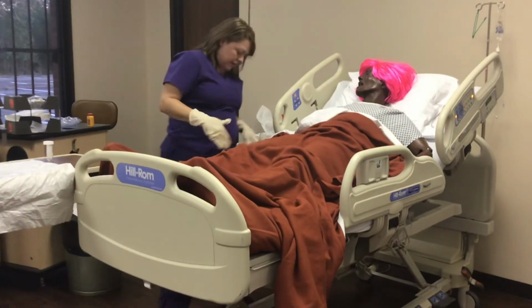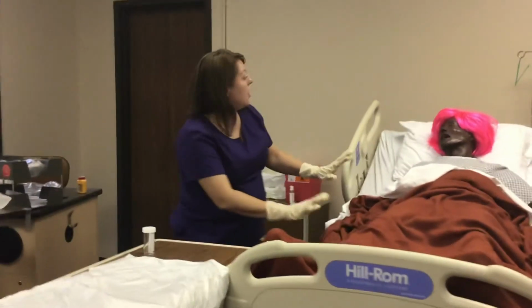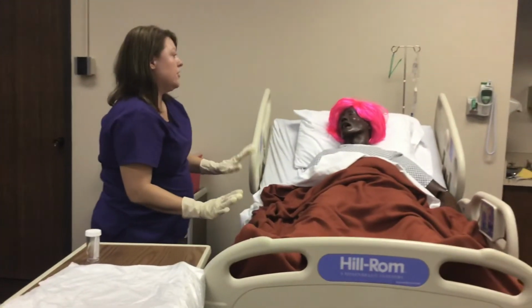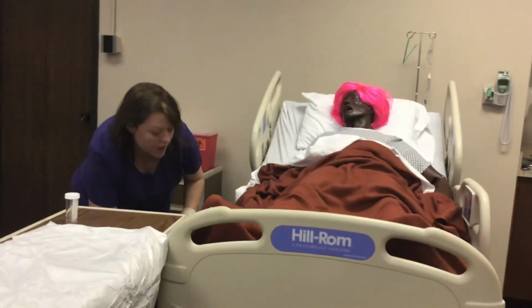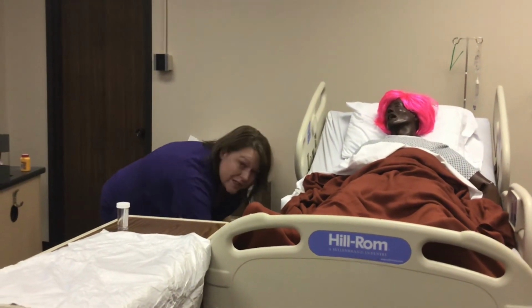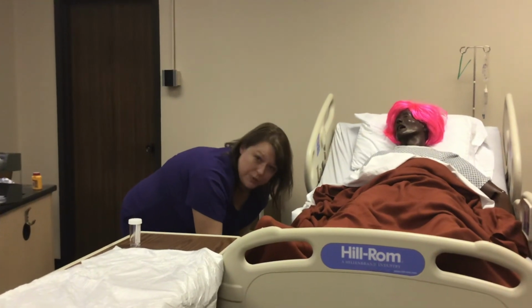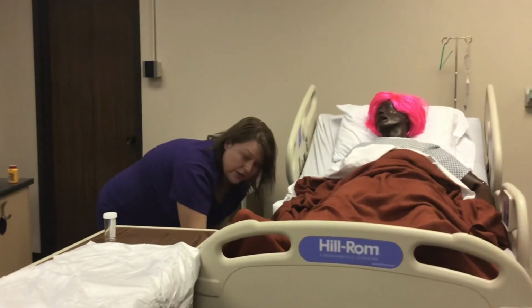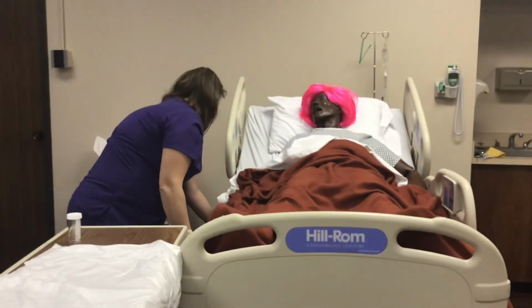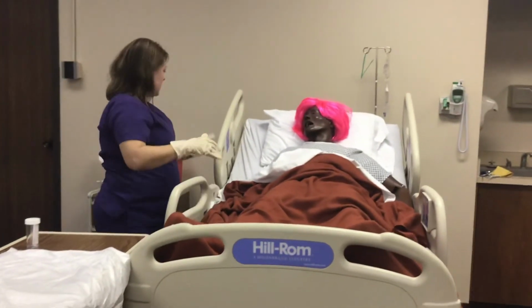All right, I'm going to go ahead and put your side rails up. Are you comfortable? Are you good? I'm going to lower you down in just a second. All right, good. I'm going to also take my pen. I'm going to label this bag with my name, the date, the time, so that people know that I'm the one who inserted the catheter, okay? All right. Side rails up.